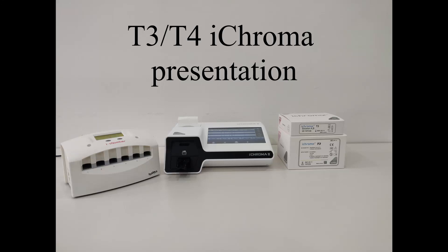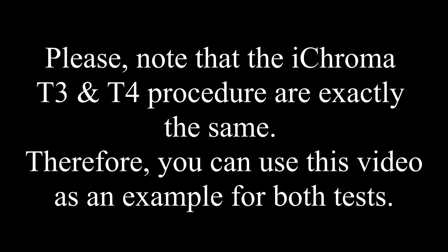T3, T4 iChroma presentation. Please note that the T3 and T4 procedure are the same. Therefore, you can use the video as an example for both tests.